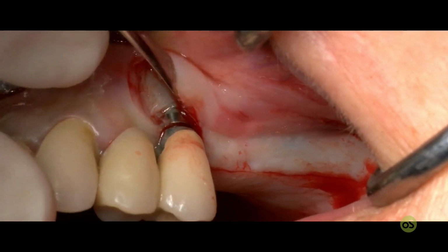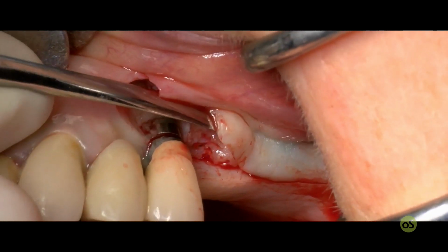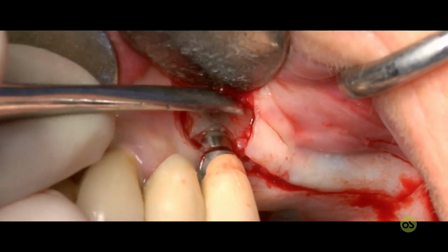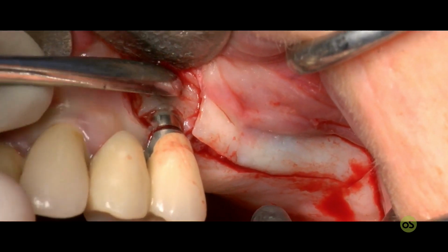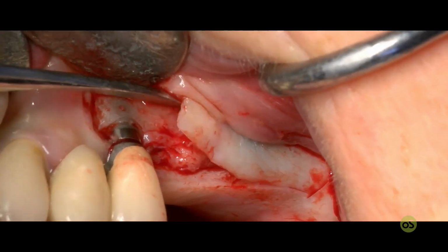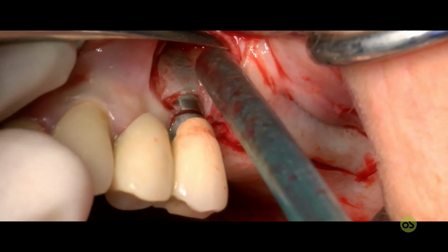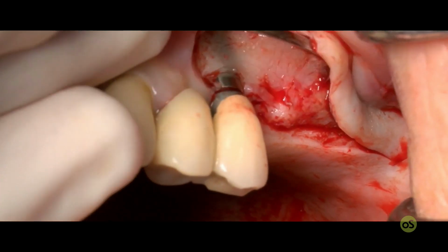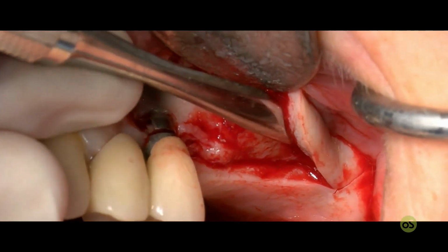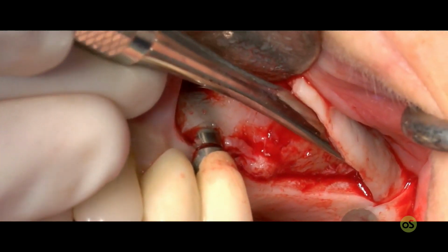At this time, I was using the manual flap elevator. Actually, I now use just the piezoelectric elevator. That is definitely better because it's not necessary to use so much force, with the risk of damaging the soft tissue vascularity. But at this time I didn't have any experience with it. So we raise the flap in order to have a huge visibility of the lateral wall of the maxillary sinus.